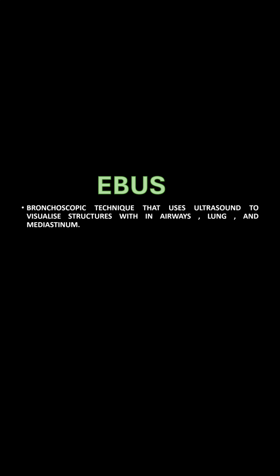EBUS, or endobronchial ultrasound, is a bronchoscopic technique that uses ultrasound to visualize structures within the airways, lung and mediastinum. It's minimally invasive and it can be done on an outpatient basis with local anesthesia and moderate sedation.